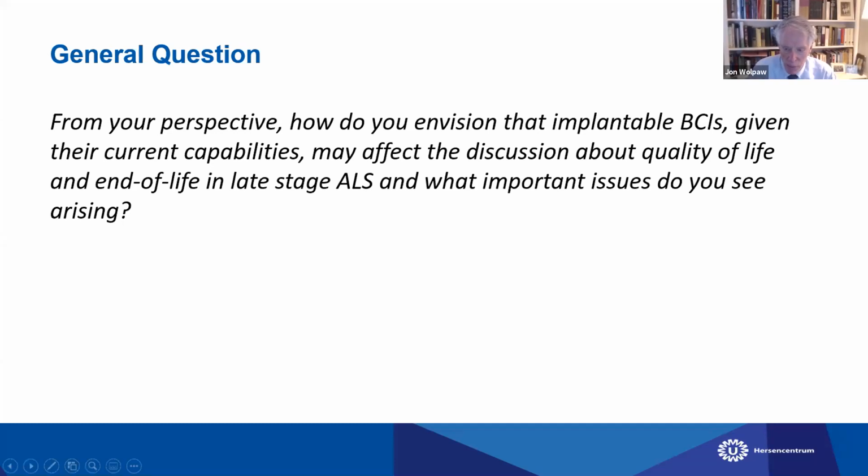Before we go on, I thought it would be good to add one other thing, that we're talking obviously about people with ALS and their particular issues, particularly because they're on a course which is continually developing. But there's a much larger population that could use these systems that really are simpler and are also a factor. Those include the large number of people severely disabled by cerebral palsy, as well as people with brainstem strokes and stable lesions. So we're talking about a good deal more than just ALS, but ALS brings up the basic issues that the others do and a bunch of additional issues.